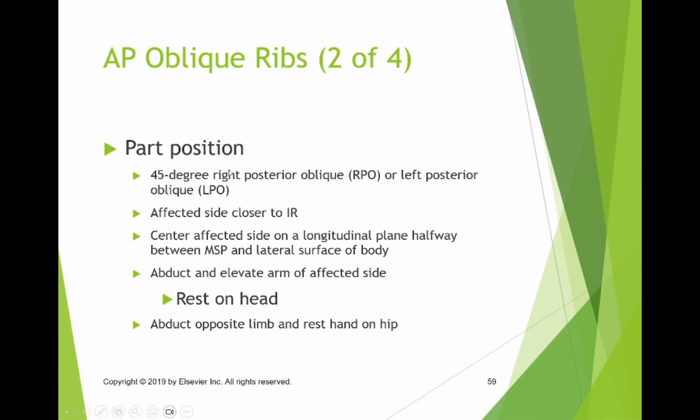So what we're going to do is a 45-degree oblique, and I'm just going to cover the one, but I'm going to explain the difference and demonstrate the difference in what you're going to see. I'm doing this from my office, so I don't have a skeleton, so what I'm going to use is my hands to demonstrate what I need to demonstrate.